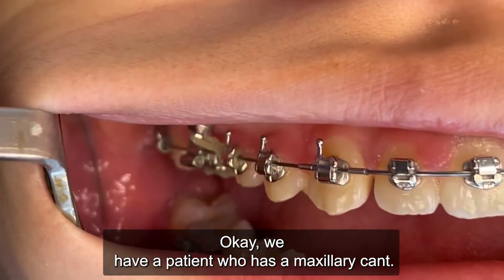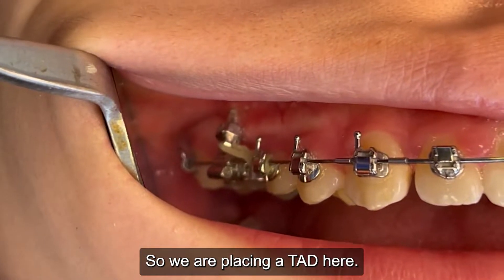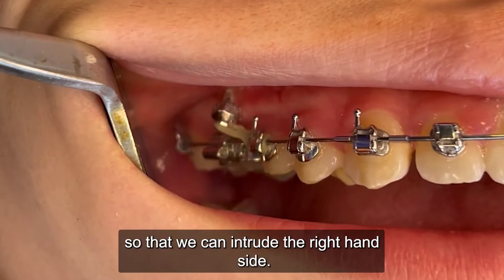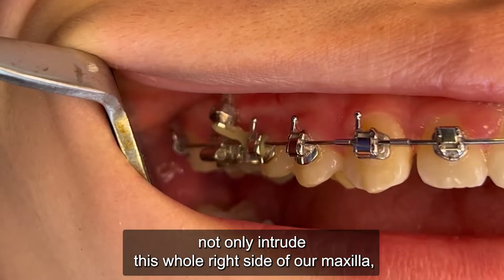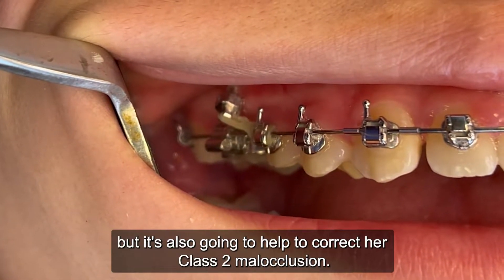We have a patient who has a maxillary cant, so we are placing a TAD here with a slightly class 2 vector so that we can intrude the right-hand side. This is going to help not only intrude the whole right side of her maxilla, but it's also going to help correct her class 2 malocclusion.